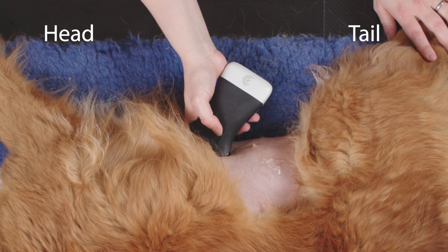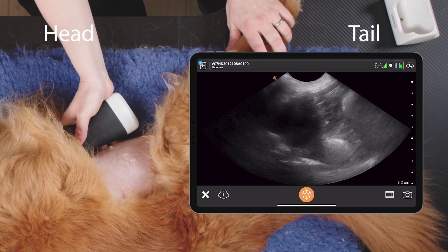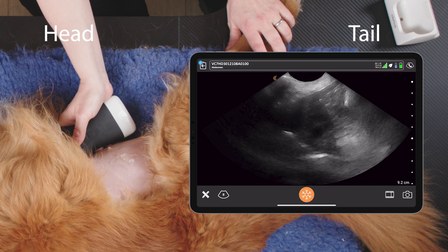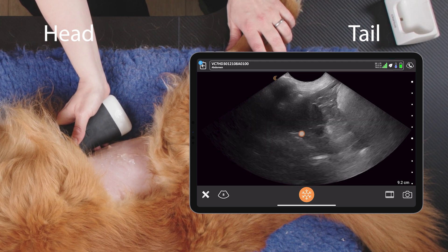We take our probe and place it just behind the xiphoid sternum. We're looking cranially, but we're also pointing the probe slightly upwards towards the right-hand side of the dog, and there we can see the gallbladder.